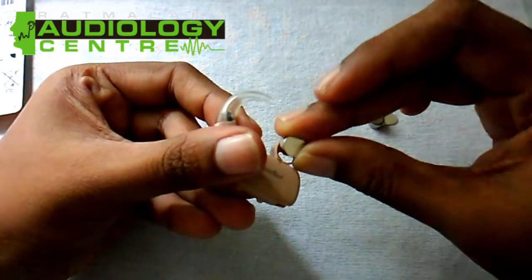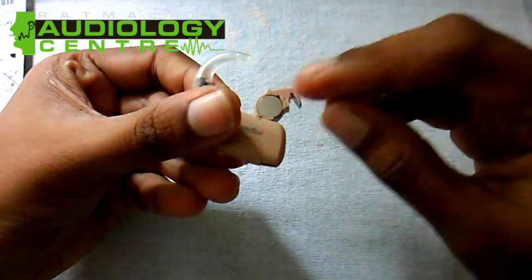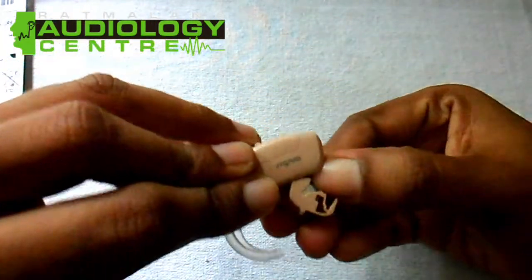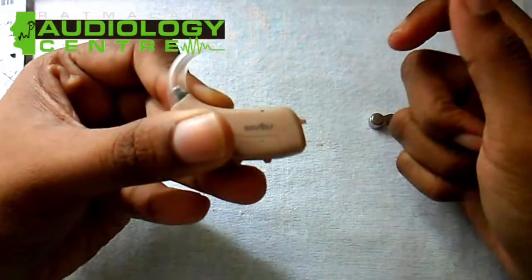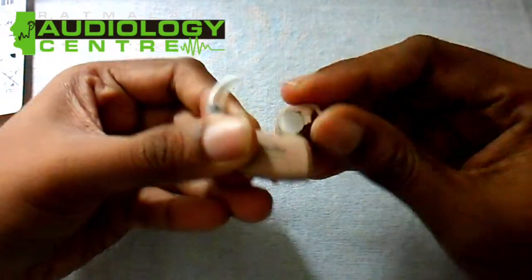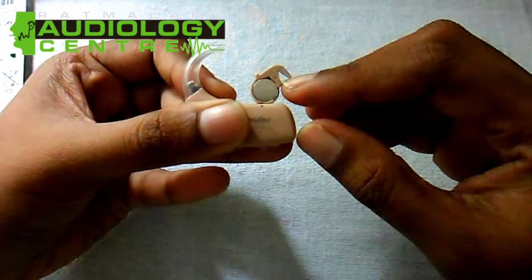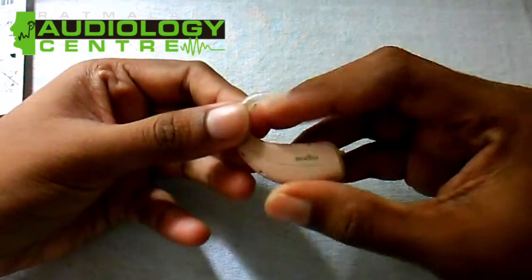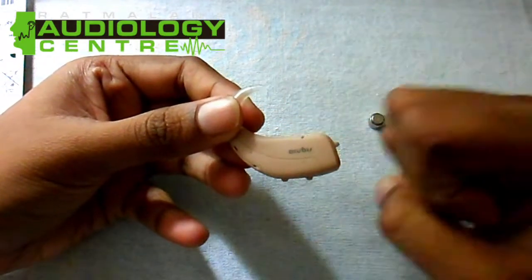I am going to show you how to use a battery. This is the first step of the process.